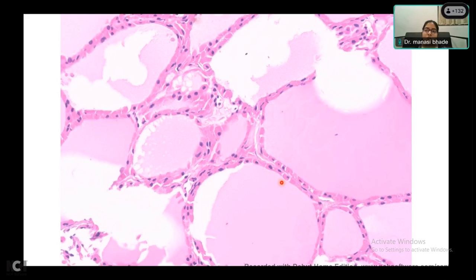So papillary carcinoma nuclear features, what are they? Nuclear clearing, elongation, overlapping. One person at a time. Somebody can take a lead. Ma'am, nuclear change in size and shape, like nuclear elongation, nuclear overlapping, overcrowding, then membrane irregularities, like pseudo inclusions, nuclear grooving, and chromatin clearing, optically clear chromatin. That's called as? Orphan Annie. Okay. Fine. So do you see them here?